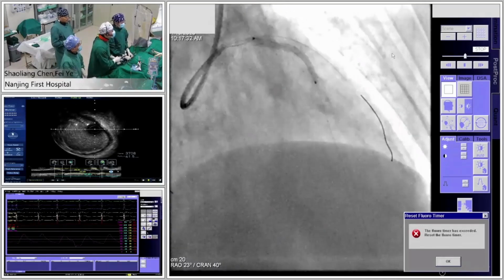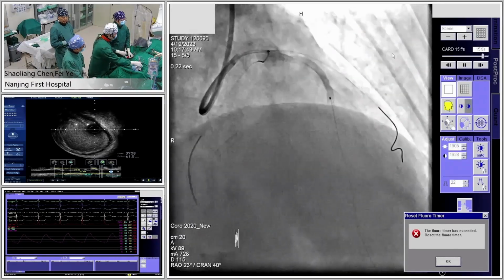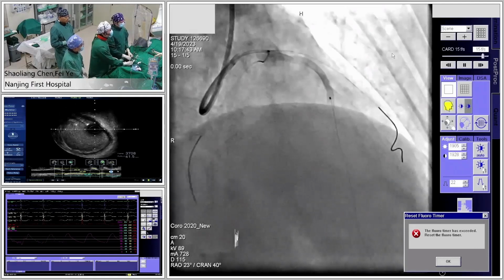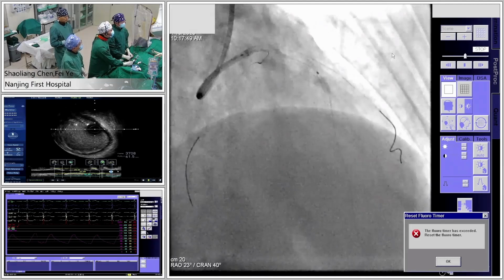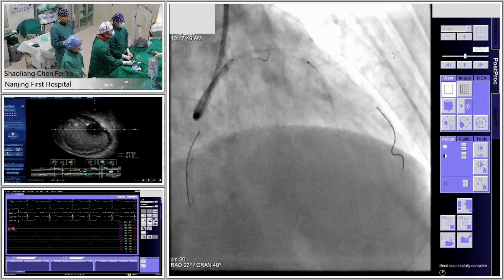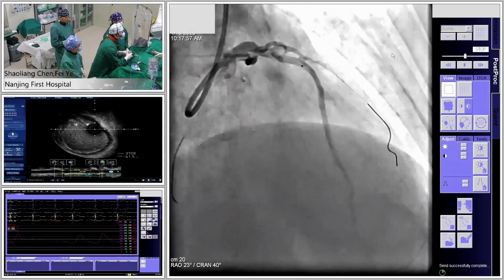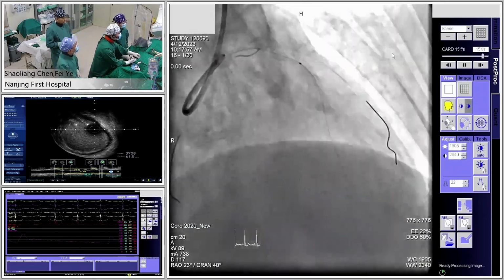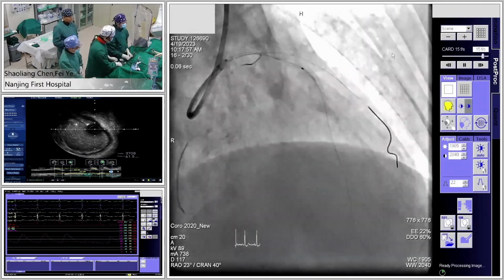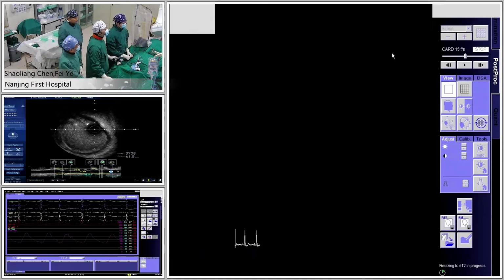This stent is also very suitable for left main disease because it has very strong backup force. In the DKCRUSH-II, DKCRUSH-III, and DKCRUSH-V trials, we also used this stent and other different kinds of stents. So now it looks much better.